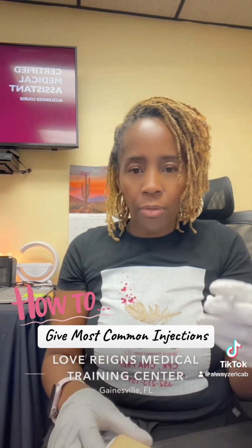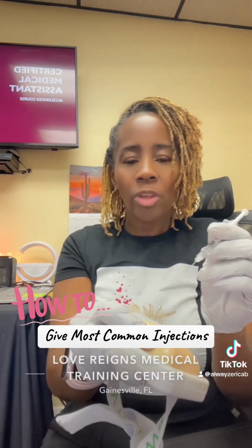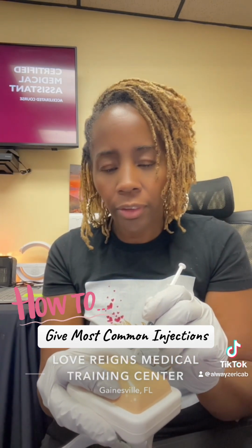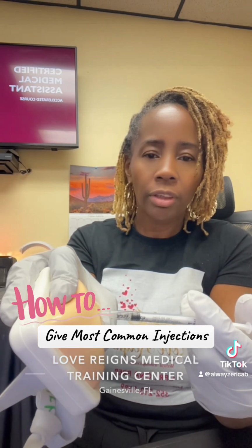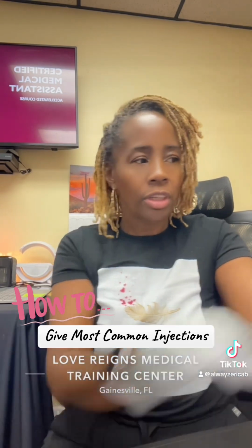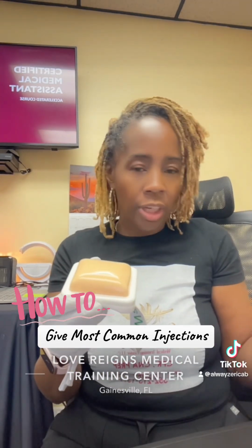So now I have my patient here. I'm already ready. I want to pinch the skin, and I'm going to go in at a 45-degree angle, kind of like you're going inside of a triangle, seen from the side, and then you're going to push that in, okay? That's going to come straight out and then straight into the sharps, okay?